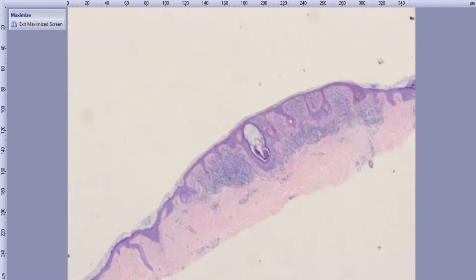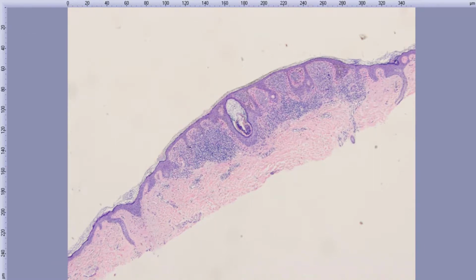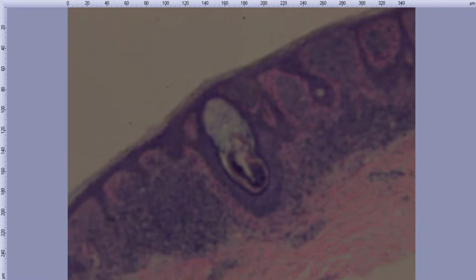So I will start on the first one, and we'll do more after this. I'll start on the first one here, and then you can either speak up and I can hear you, or type it in if you can't speak into it. Hey guys, thoughts on the first one? Don't be afraid to just blurt it out.